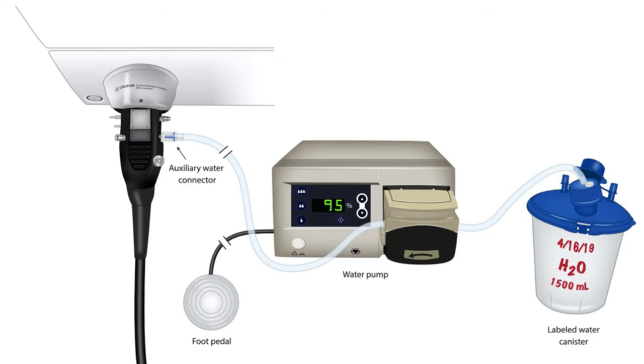If you want to use the water jet, you take 2 vials of either methylene blue or indigo carmine, and then mix them in either 250 ml of water, or if you have a bigger jar, you can use 1500 ml. But the goal is to have a light blue, sky blue color, and that is important to do.